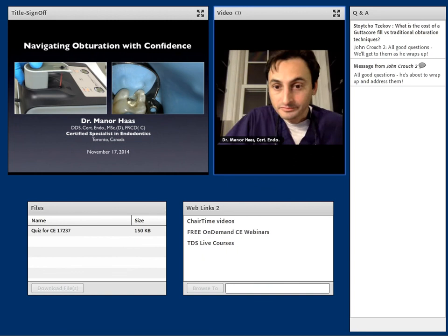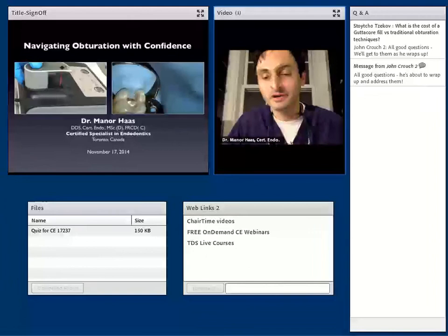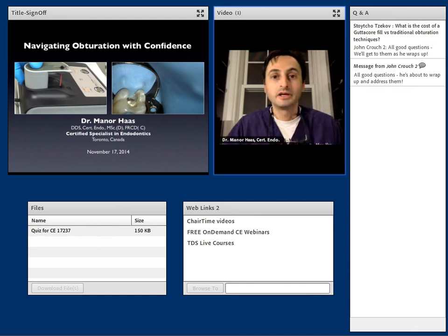Someone was asking a question. What's the problem with voids and plugger tracks? Okay, then. I'm not sure if you're being sarcastic with that or not. Well, you want to fill the canal system. There are studies showing that one of the biggest reasons for root canal failures is, in fact, incomplete obturations, having voids. And there are studies on this.